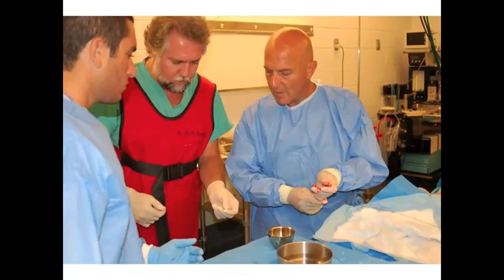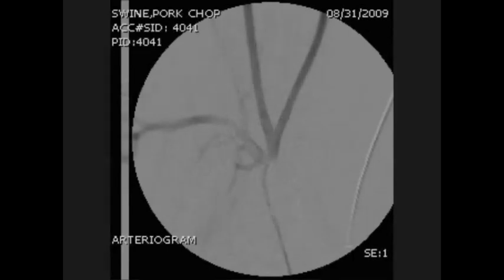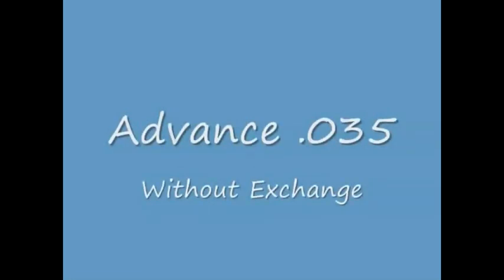Here is part of the animal work done at MUSC. This is the angiogram on a pig model — you can see both carotid arteries. Under fluoroscopy you advance the 0.014, which is already together with the 0.035 coaxially placed, and then you advance the 0.035. You can see the tip of the 0.014 does not move.